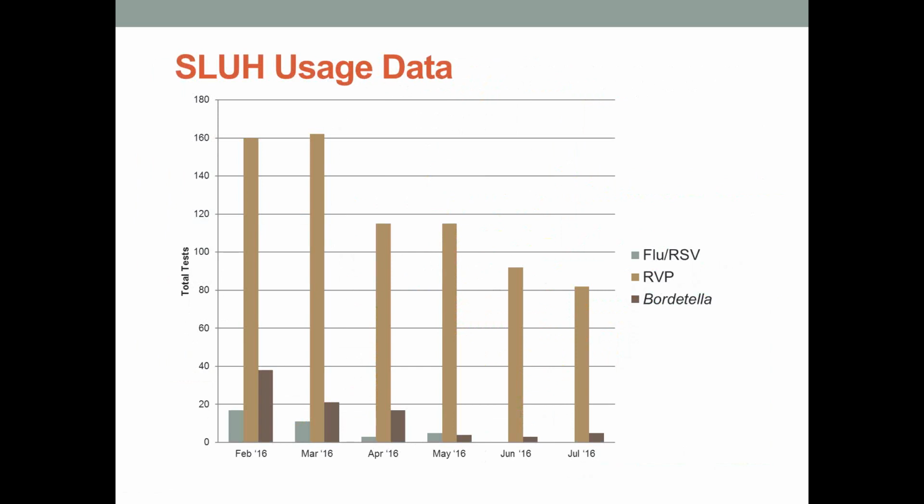But what we realized on inspecting this further was that most of our patients are coming in through the ED, other than the BMT, who are always getting the complete profile. Our patients coming in through the ED are still getting the rapid flu antigen first. Part of that is we're not staffed overnight for molecular testing purposes, and also just the really fast turnaround of a rapid flu. So while we know it's not very good, it lets the ED get some quick data.